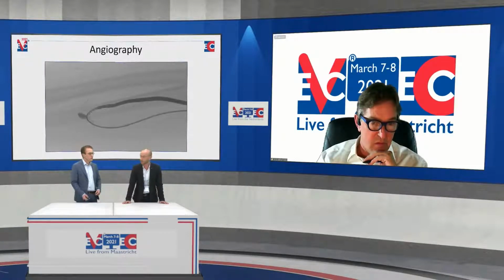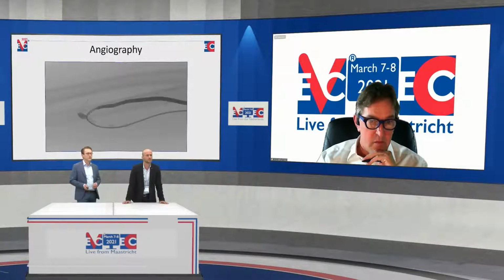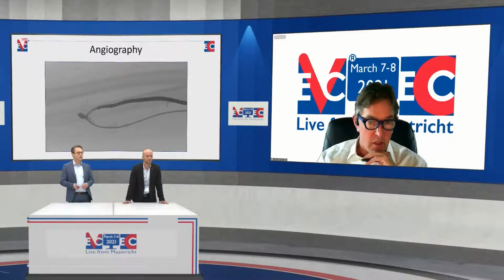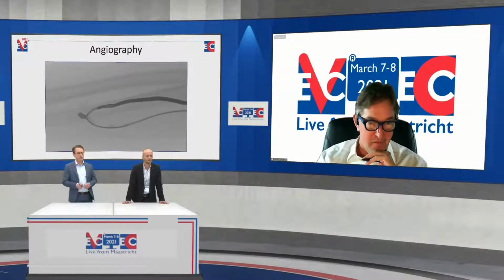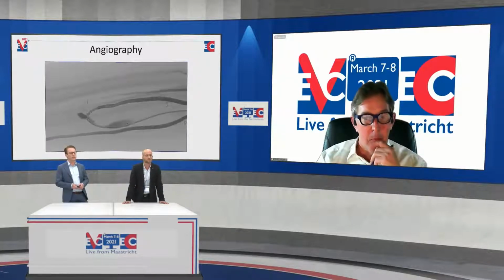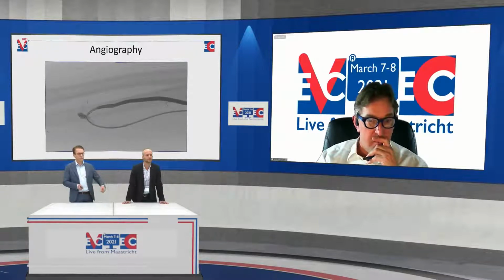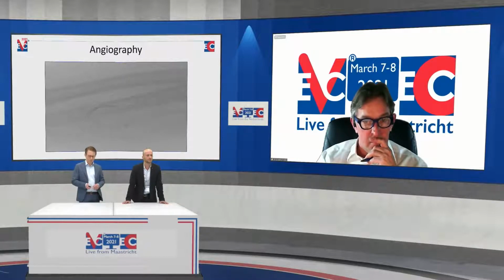Yes, I think you can tell by looking at the size of the catheter. It's almost the same size as the diameter of the vein at that point. So this, I think, confirms the findings on duplex ultrasound that there's a juxta-anastomotic stenosis. Yeah, you punctured countercurrent, a retrograde cannulation of the cephalic vein. You can see the sheath, and you can see the catheter going around the loop of the anastomosis inside the radial artery.